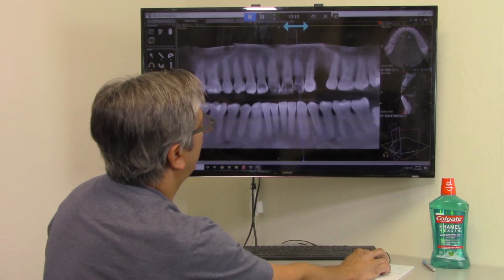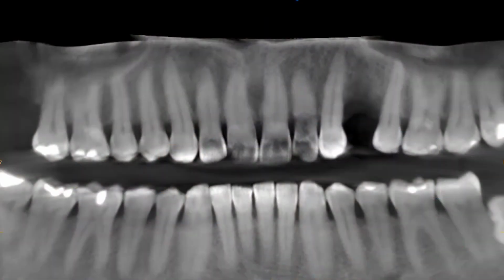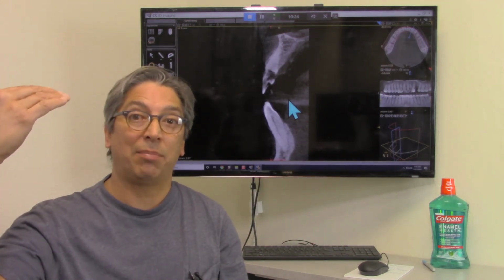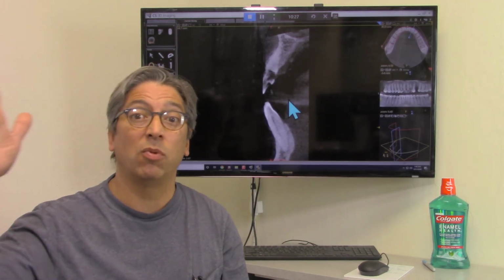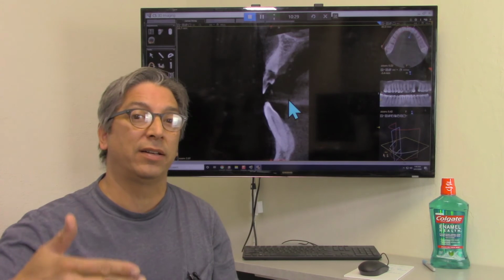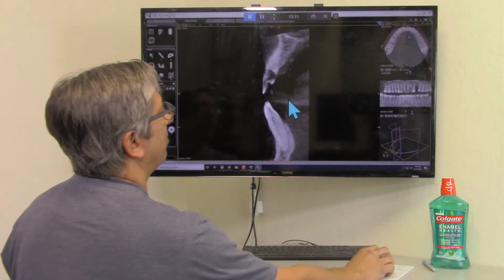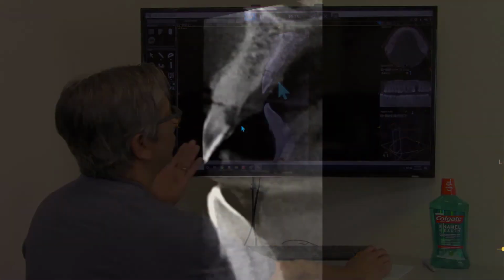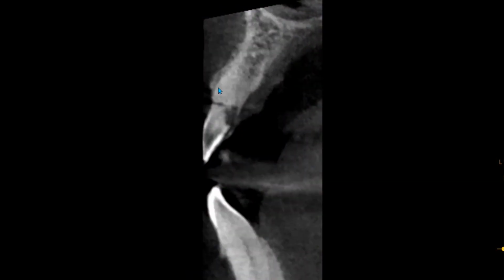And if you're going to put an implant, let's just say this is what you got here. This is right down the middle, and you can see we got a little sliver of bone here. That little sliver of bone actually really, really helps. That helps hold that gum line up higher than it normally would. It wouldn't give that giant defect that we saw on the premolar tooth. So that's really helpful, and I'll go across the root, and I see that consistently across, which is very good.